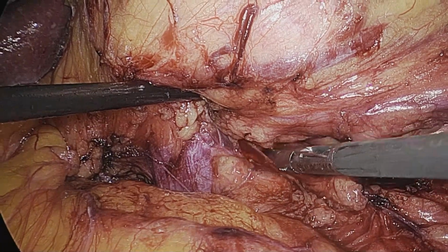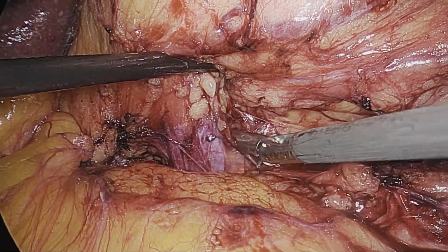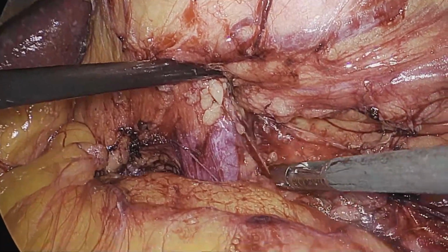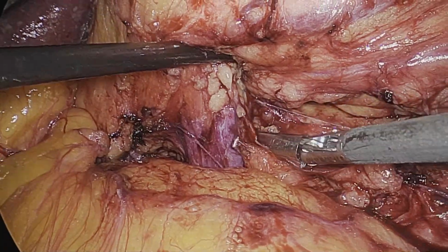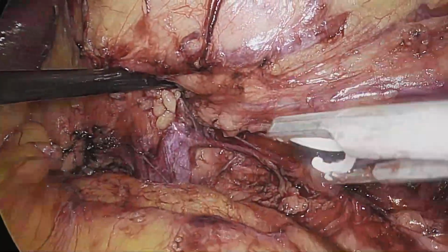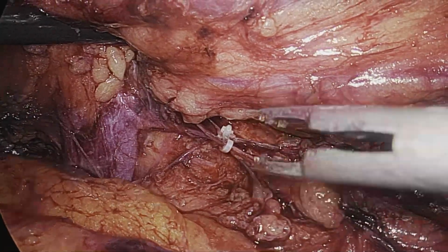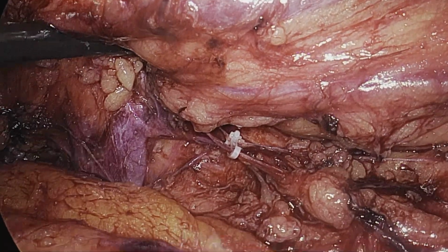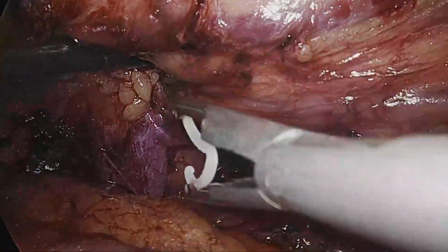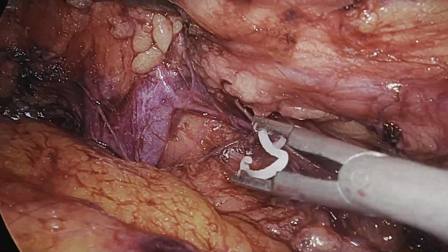There is a thin lumbar vein draining into the renal vein also. So we'll clip it and cut. And there are a few lymphatics which are running over it. Clipping this vein is very important, because only after clipping and cutting this vein will we be able to go behind the renal vein so that the renal artery can be dissected.